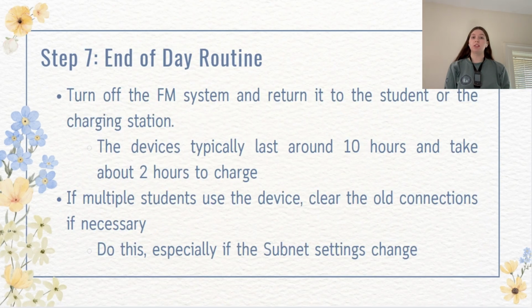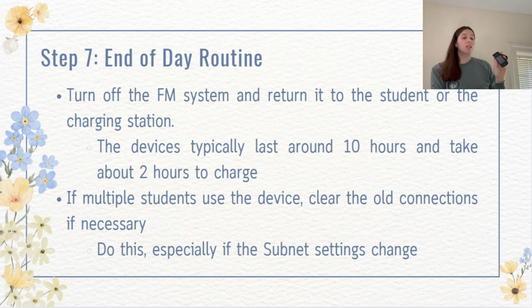For step 7, these are the steps you're going to take for the end of day routine. You're going to take off the device and you are going to either put it in the charging station or give it back to the student. Some students have accommodations where they can take the device home, and if they do, remind them to bring the device back the next day and to put it on the charger. If you are still in possession of the FM system, you can delete old connections if necessary, or if the subnetwork settings need to be changed, you can do that as well.